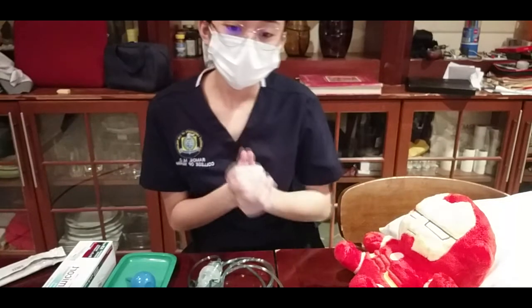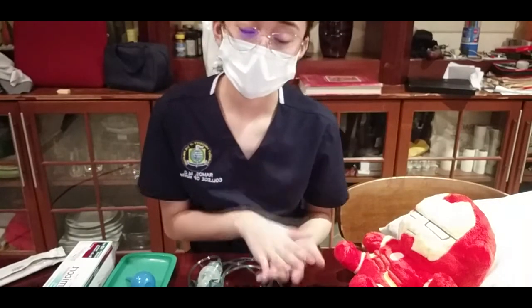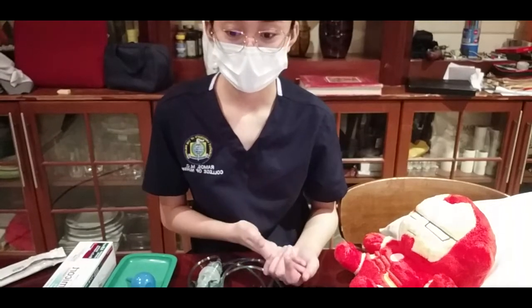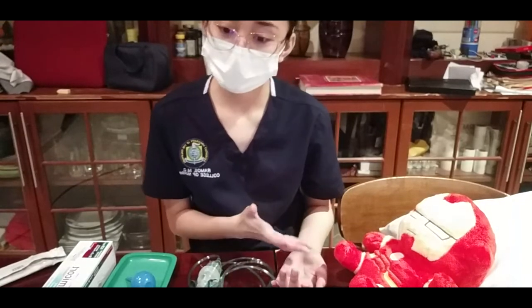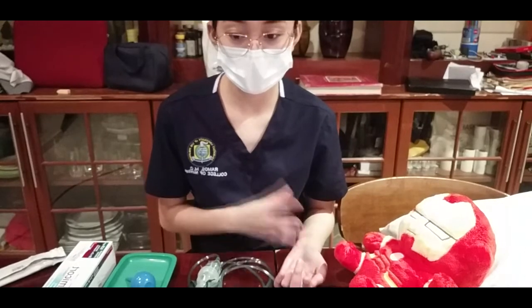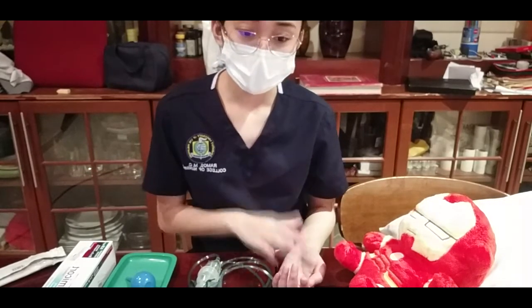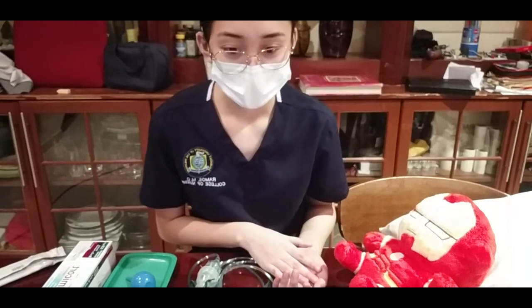Okay, so next off, I will be explaining the procedure to the patient, and since our patient is an infant, I will be explaining the procedure to the family. So ma'am, today I will be performing the oxygen therapy, and this is extremely beneficial for those who currently experience low oxygen, like your child, regardless of the reason, and if needed, regular utilization of oxygen therapy can allow people to be more active and mobile by decreasing shortness of breath. In explaining the procedure, this increases the compliance and cooperation of the patient.